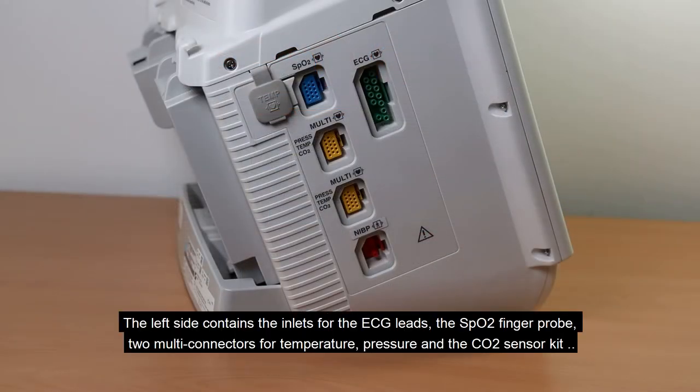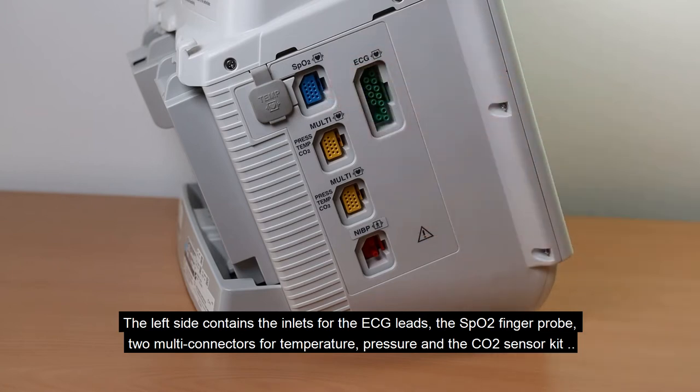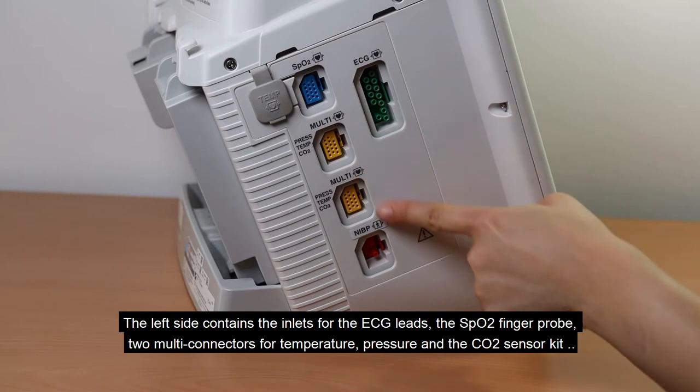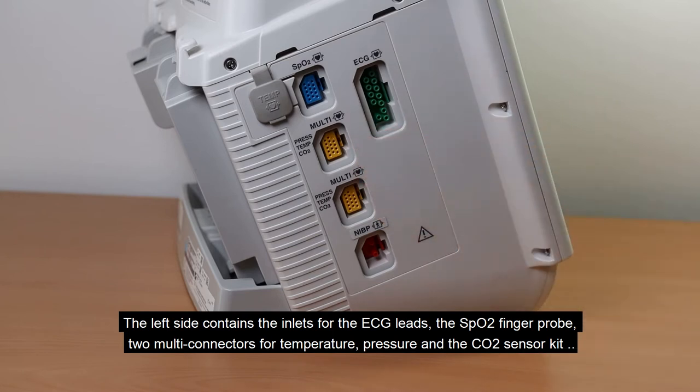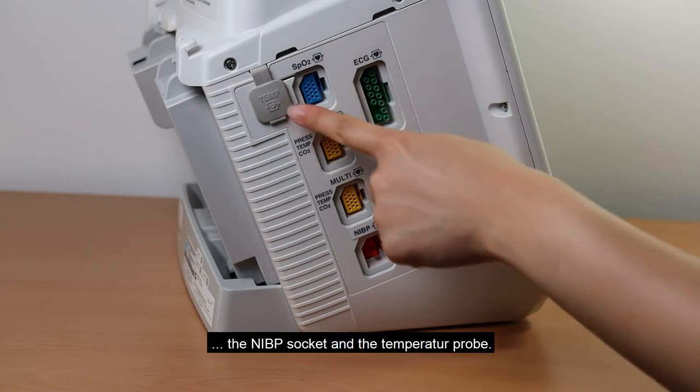The left side contains the inlets for the ECG leads, the SpO2 finger probe, two multi-connectors for temperature, pressure, and the CO2 sensor kit, the NIBP socket, and the temperature probe.